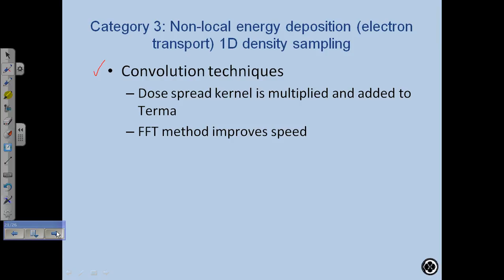Okay, so in homogeneous mediums, the kernels typically look like this. If you plot the matrix, it looks like this. It kind of looks like a teardrop. Okay, so it's narrow down here and wide here, and what this means is that the probability of forward scatter is high. This is like a high energy, like an 18 MV kernel. The probability of forward scatter is very high. The probability of back scatter is low, and the probability of side scatter. So it gives you a probability distribution of where the photons are going to go.